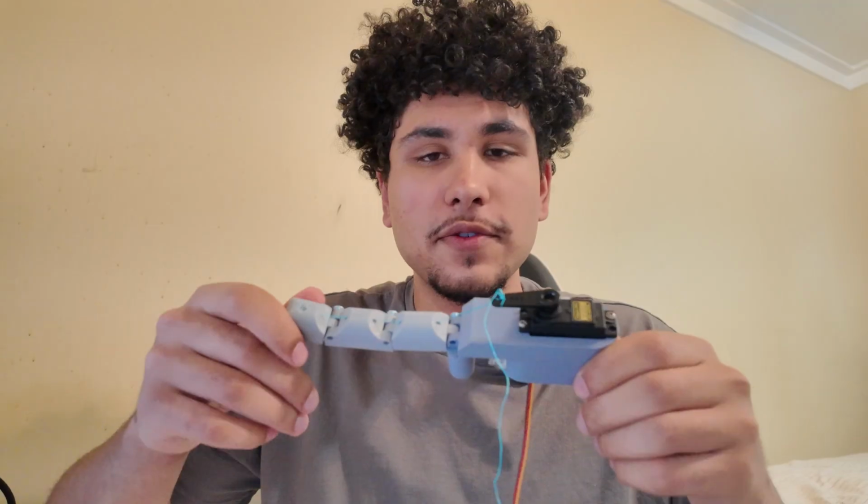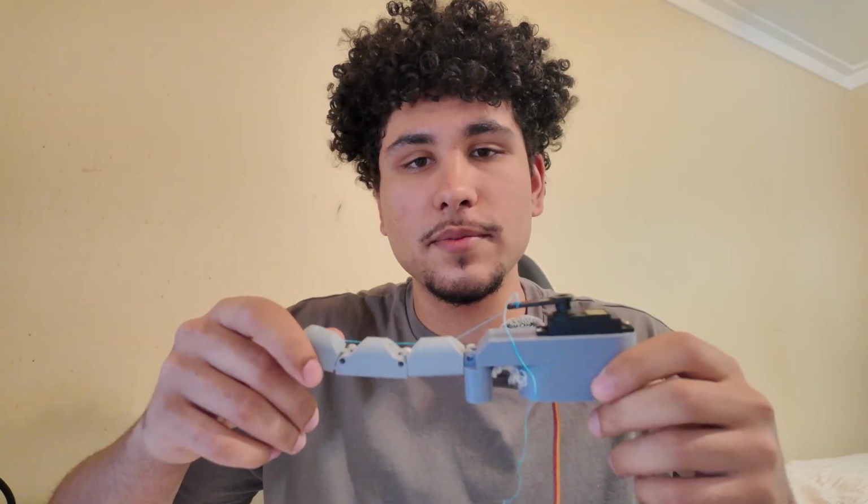This is the final, not so final prototype finger. It's not final because it doesn't really look like a finger, but let me explain how it works. There's a string that runs with the front of the finger connected to a servo motor, an elastic band in the back. The elastic band snaps the finger back into place, and the servo motor rotates to contract the finger. When the servo motor rotates back, the finger straightens. Pretty simple pulley system.